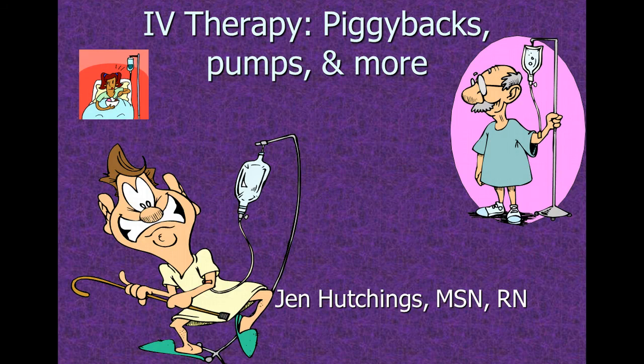Hello, we are going to be talking about IV therapy, piggybacks, pumps, and more. IV therapy is used to maintain or prevent fluid and electrolyte imbalances. Follow the 6 rights of medication administration and 3 checks with IV therapy.